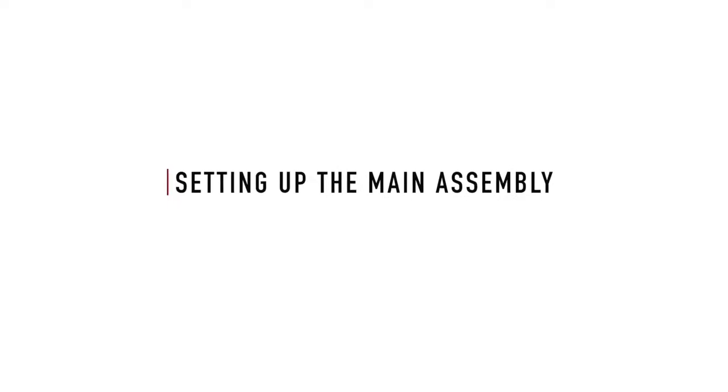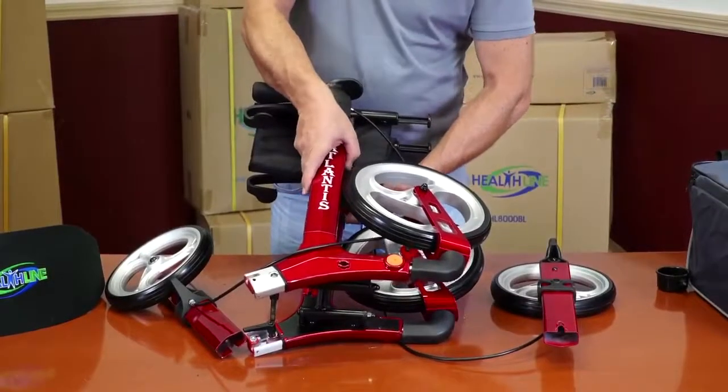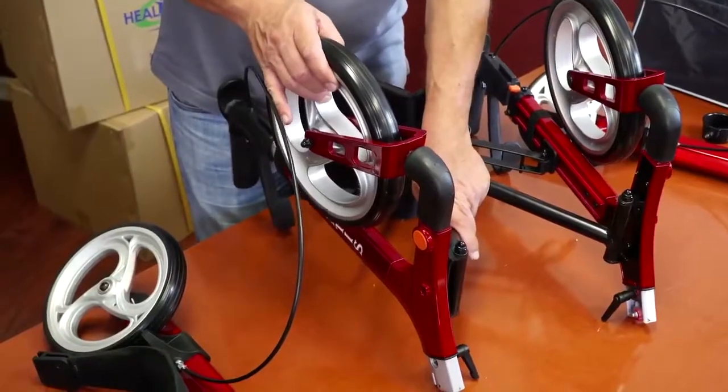Setting up the main assembly. Begin by unfolding the main frame assembly as seen on the video. The large front wheels should be facing out. Now unfold the wheels.